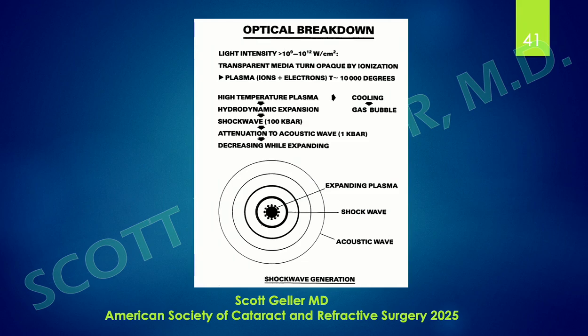So you have this high temperature plasma, which creates a hydrodynamic expansion, a shock wave, and that is ultimately cooled and gives you the gas bubble phenomenon. So it's the shock wave that actually does the work we're talking about.